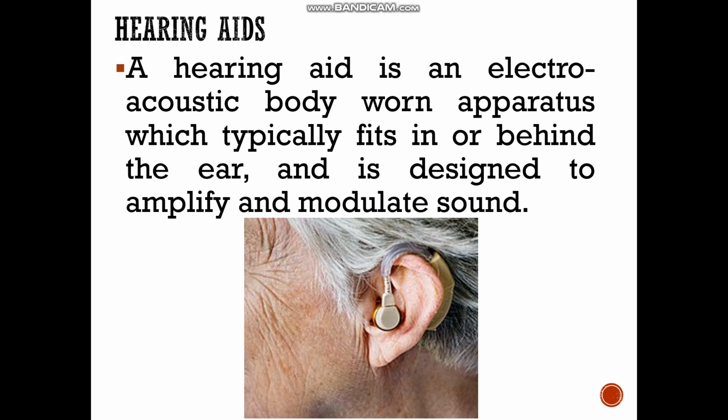So coming to the hearing aids. In second year you have the topic hearing loss, and under that topic you might have studied hearing aids, what are the types, etc. The same thing, it is like a rewind or revision. So you can read that note also.